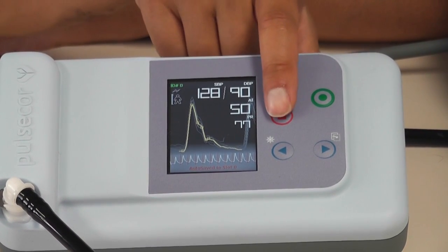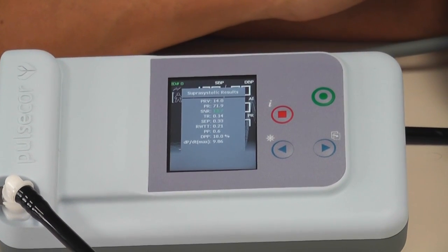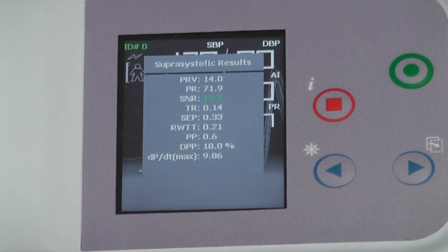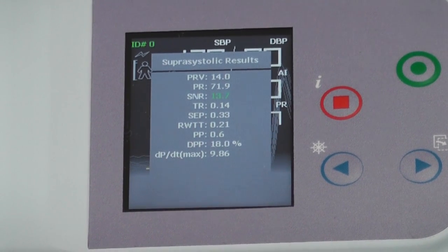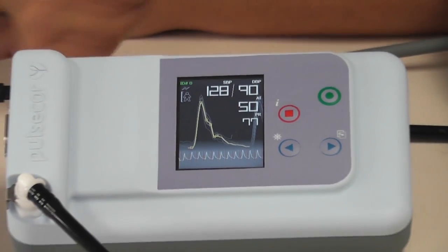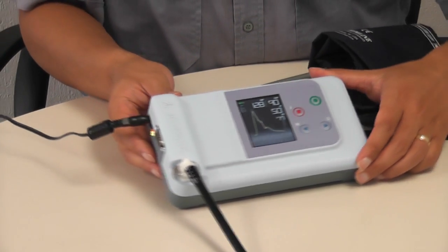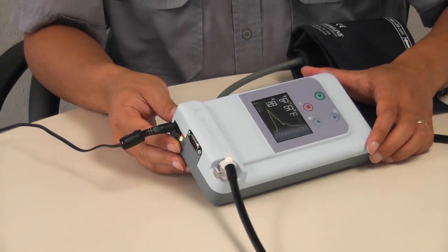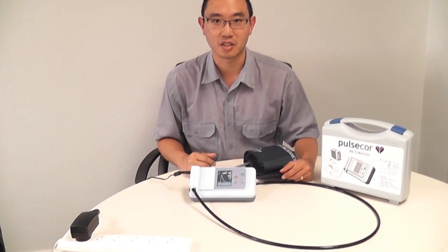Apart from all of that, it also calculates a number of other parameters, including a signal-to-noise ratio, which gives you an indication of how clean the signal is. In this case, 13.7% in green means very good. All of those parameters are available, including a waveform, to be logged to a computer via the serial port on the side or a serial-to-USB adapter. So that is the PulseCore R6.5 monitor. As you can see, it is very simple to use.